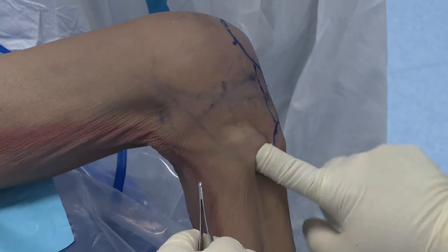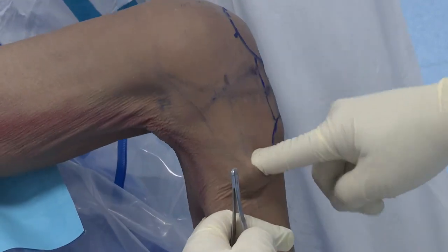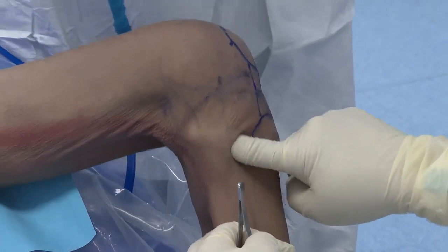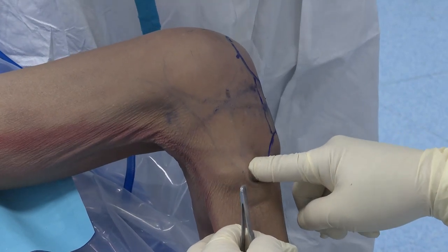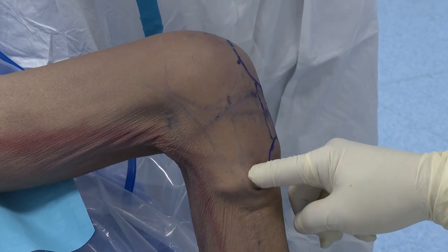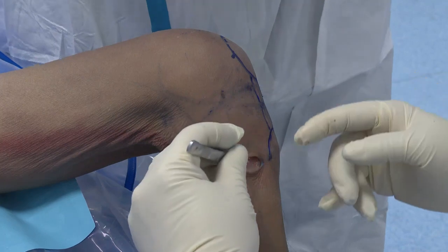Okay. 在皮下这样子拨，是不会损伤到神经的。Okay, good. So now you can feel the tendon is here. 这样一边拨是能够摸到肌腱的。Yeah, okay. Yeah, very nice. Here, can you see my finger? Yeah, 大家也能看到我手指。We can feel the tendon is here. Okay? 这里就是肌腱的地方。So it's the right position.